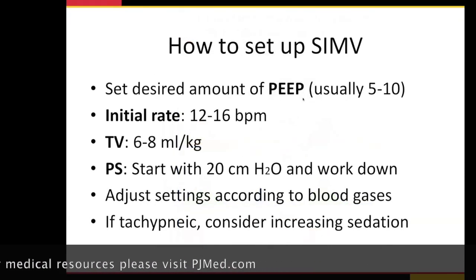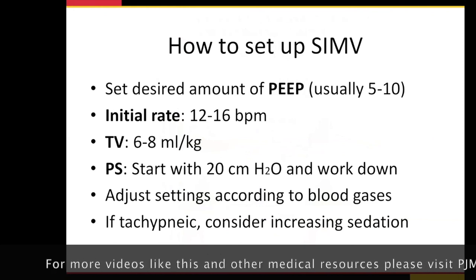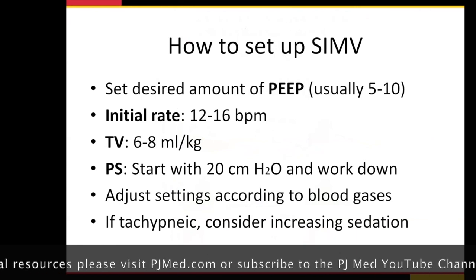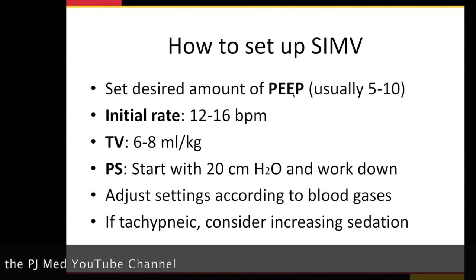The way you set this up, I'm going to go through orders in just a second here, but you put your positive end expiratory pressure. I'm going to argue to you that almost every patient, especially our COVID patients, are going to need some PEEP. PEEP is the back pressure in between breaths that keeps their airway stented open. So starting with 5 or 10 of PEEP is not the wrong answer for most patients. We'll talk about that in a minute.